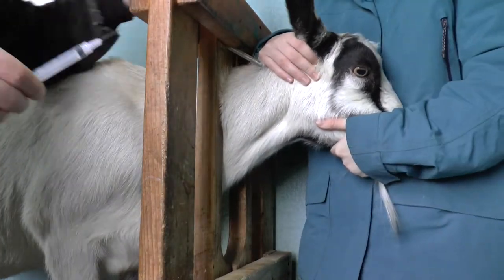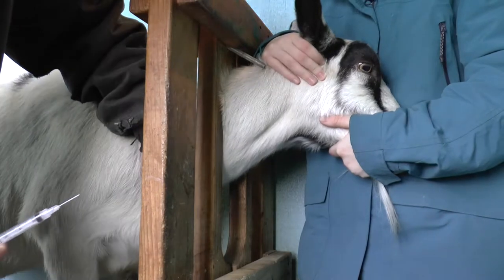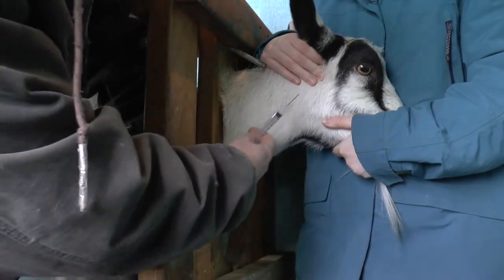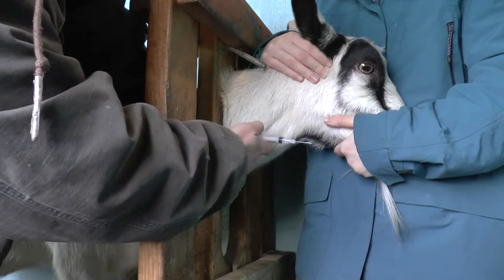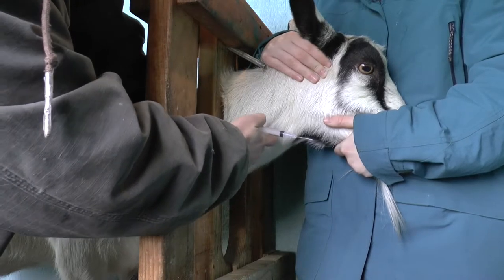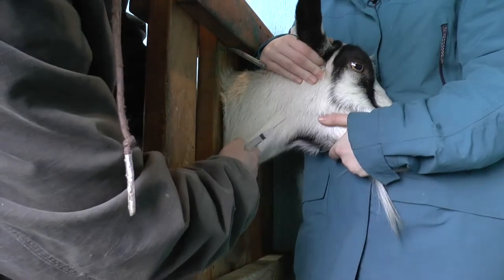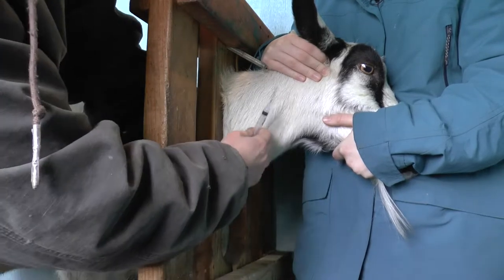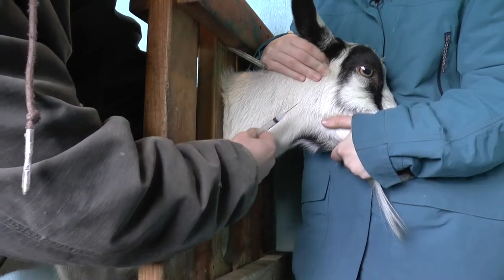I'm going to get my hand as far down here as I can. This groove goes all the way down to her point of shoulder, so you follow the groove down and then jab your fingers into it and hold it off the best you can, and it'll puff up the vein with blood. You can feel it puffing up. You'll wait until it gets nice and big because that's what you're going to be jabbing into. Then put your needle at the angle of the neck — because if you don't, you're just going to be stabbing right through the vein. Keep it at the same angle as the neck.